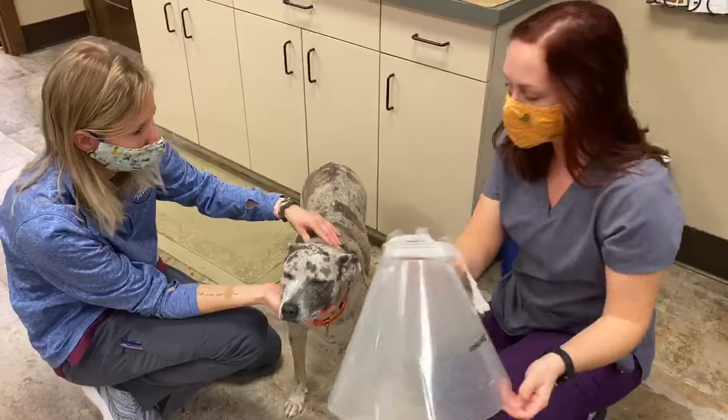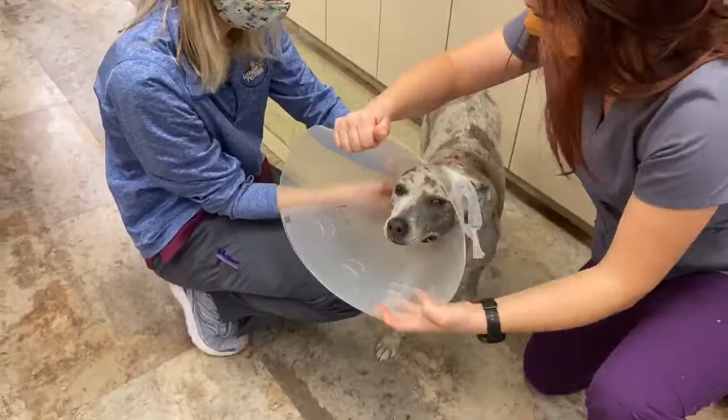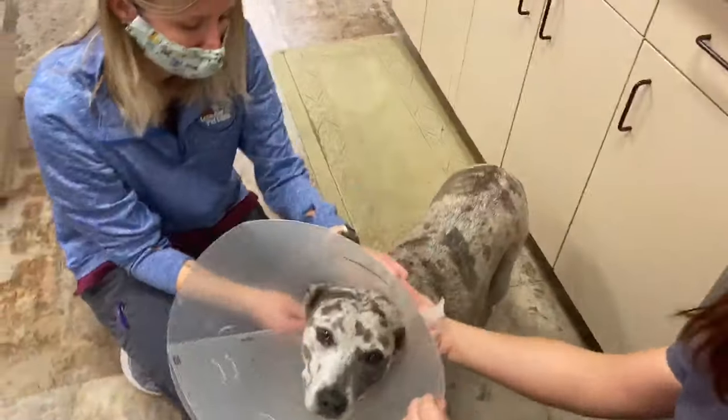This was pre-sized to her neck, so we'll slide it right over. Nice and easy. Make sure the ears get through there.